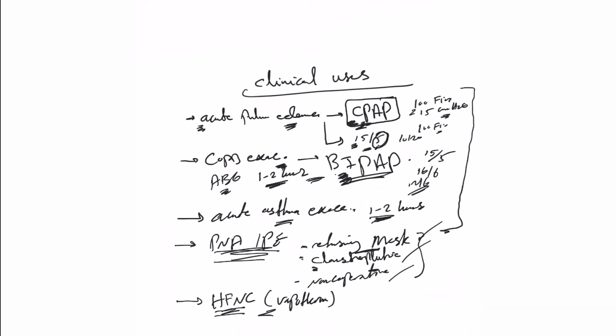I don't think about high flow nasal cannula first, and I don't offer it first when I think about non-invasive ventilation, but it's an option. And this is mainly an option for hypoxia. Not much for ventilation, although some say we can still use it for ventilation and help with hypercapnia in COPD. Even the manufacturer mentioned that. But take it from me, when you think about COPD or anything, think about non-invasive ventilation, think about these first, and then this after that. So these are the acute indications.